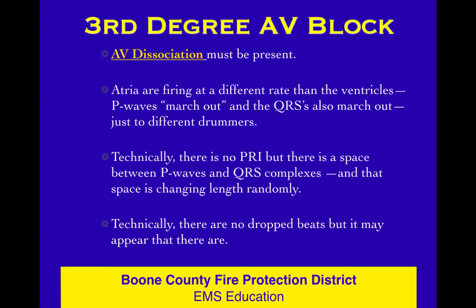This is two different drummers playing at the same time, and one's not keying off the other one. There's no correlation between the two of them. And so you have the P waves at their own rate, and no one really cares what that rate is because it's the ventricular rate that matters. Some examples of this, a couple of folks had talked about the windshield wipers on their old school bus or on the old fire trucks, where the right wiper does whatever it wants and the left wiper does whatever it wants, and they're not in sync in any way, shape, or form.